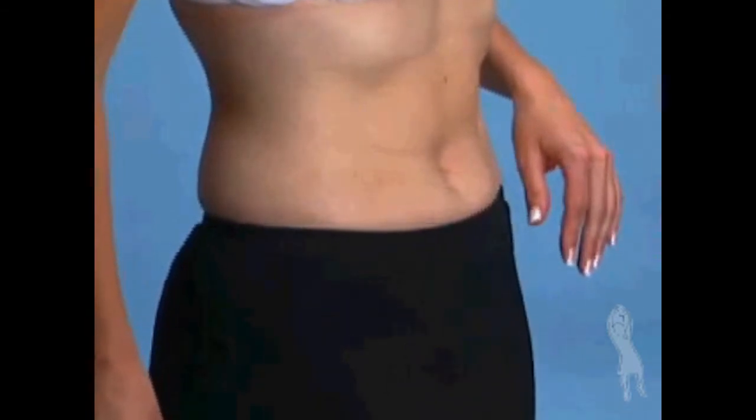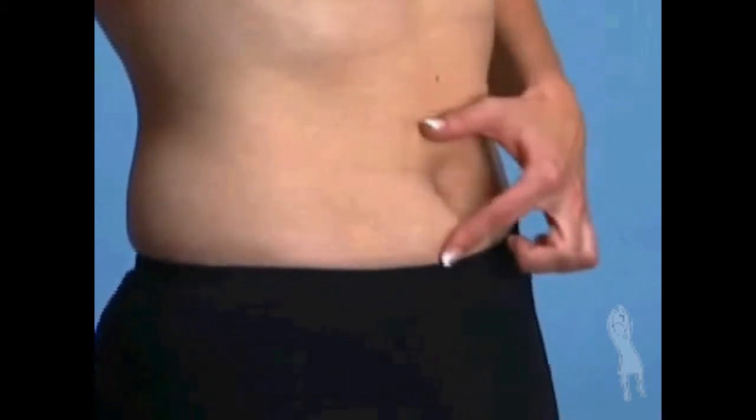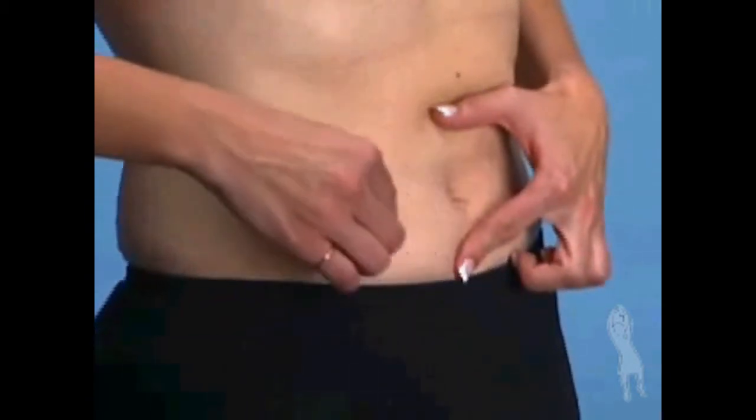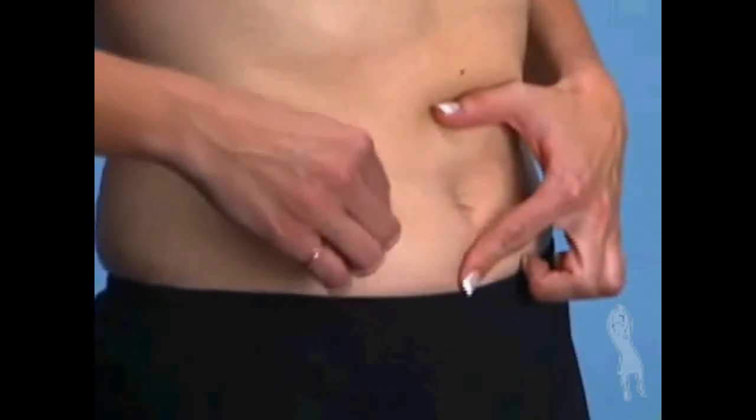The best place for the subcutaneous injection is the abdomen in the area just below or to the side of the belly button. Change your injection site a little bit with each injection to decrease your chances for a skin reaction.